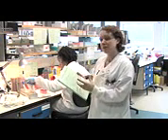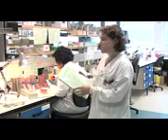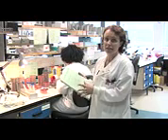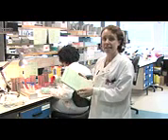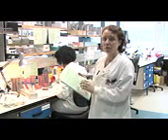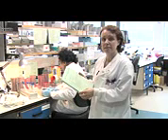We would check the demographics and the details of the sample, and then culture the sample onto various media, sometimes basic nutrient media such as blood agar and other selective media dependent on what we want to grow from that particular sample. We also do microscopy on specific samples. We would do gram stains and look for the bacteria under the microscope.